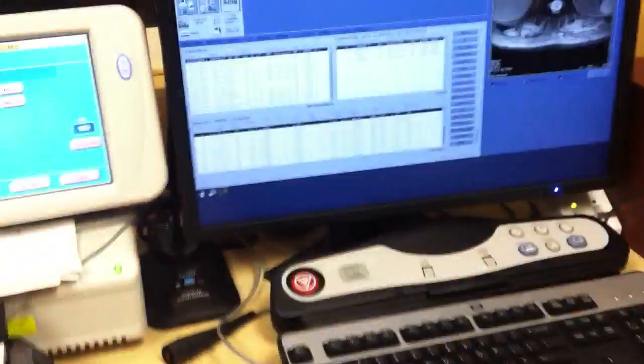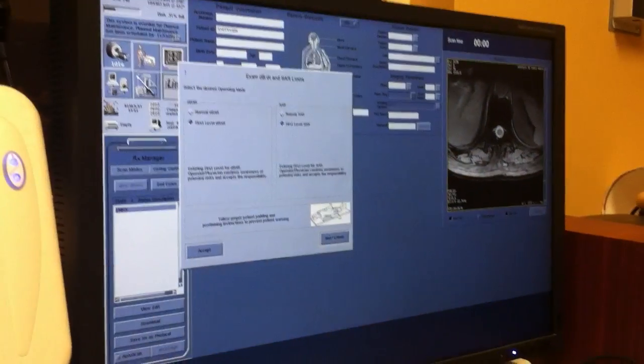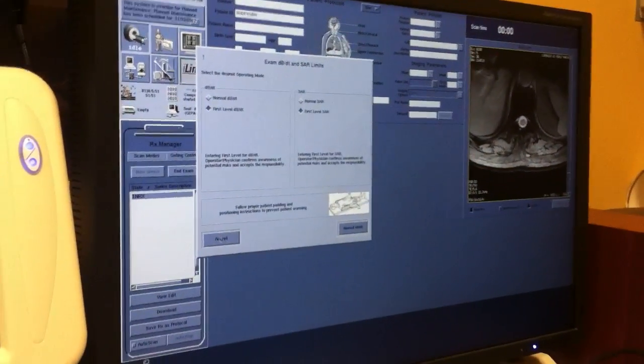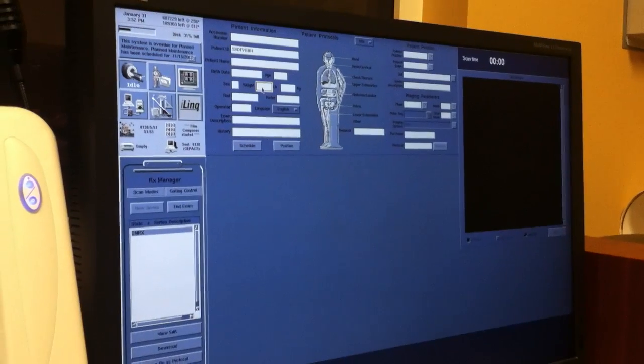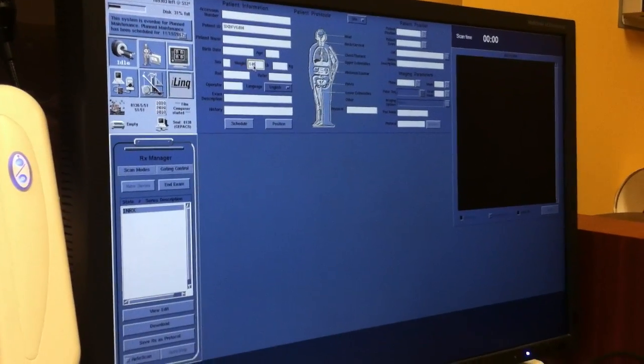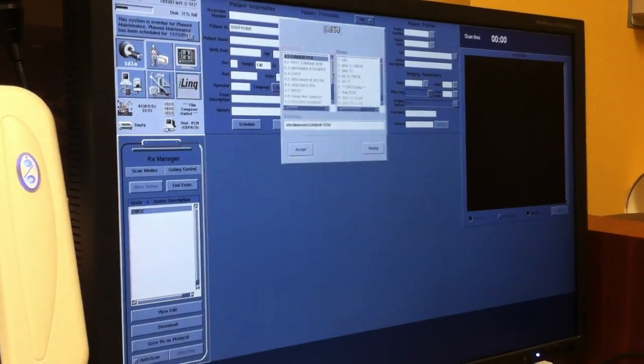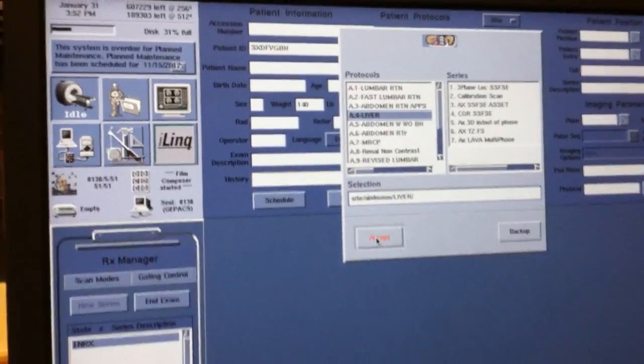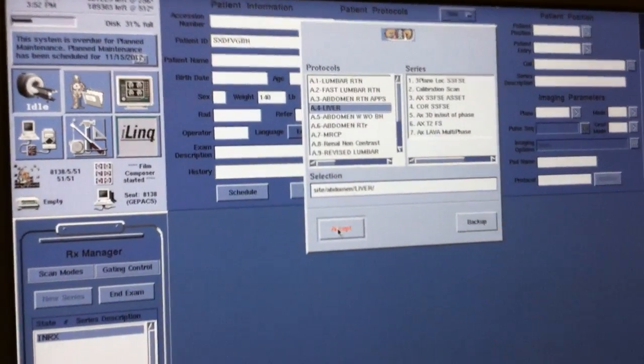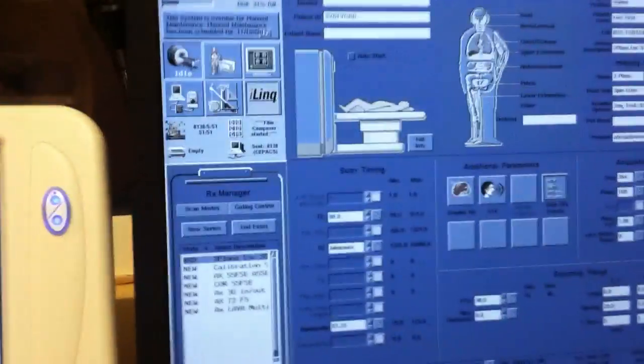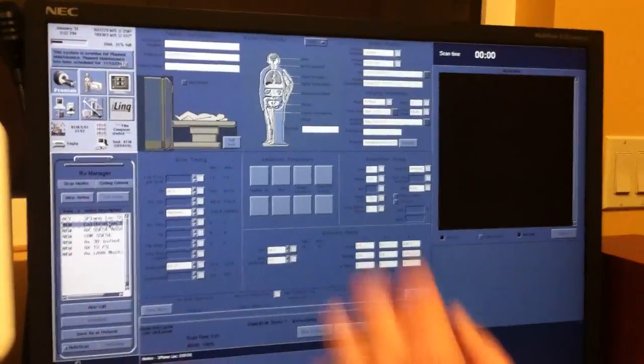Now we'll go to the control center. Once you're at the console, we're going to set up for a liver here. Now, your liver might be labeled something different. In this case, this is our multi-phase liver. It's also known as lava on this particular machine. So, we're going to run our three-plane loc. While our three-plane loc is running, we're going to set up our power injector.